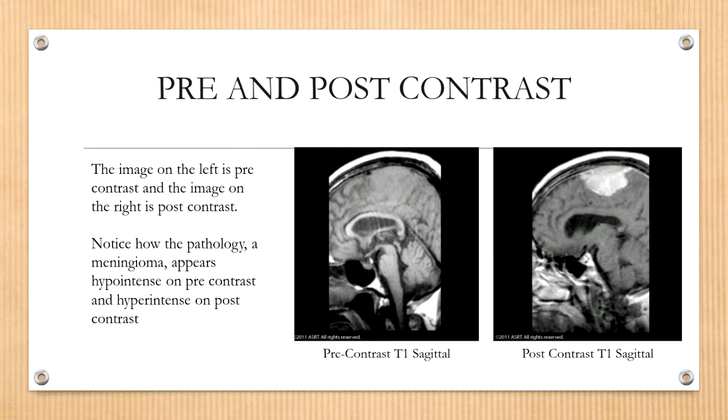So for instance, on this slide, like I mentioned, we are using a rectangular field of view. So automatically you should be thinking about what the consequences of using this type of field of view are. Well, I'm running the risk of aliasing, or possibly other types of geometric issues. So start thinking about that. All right, let's go back to the pathology.